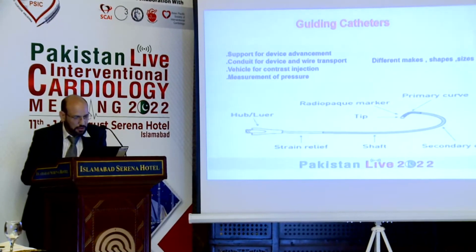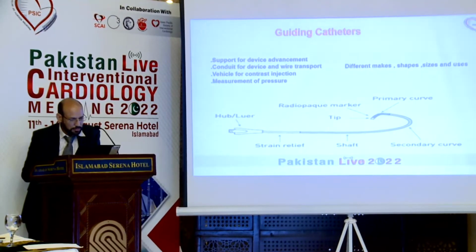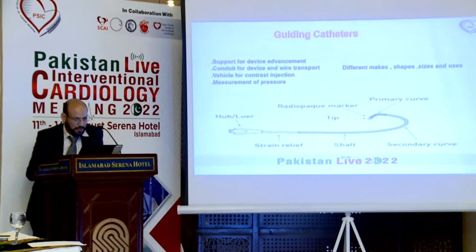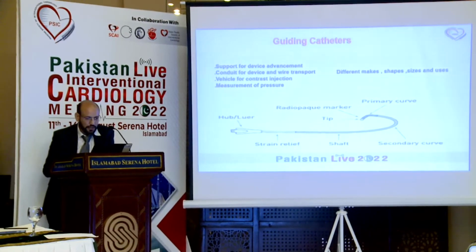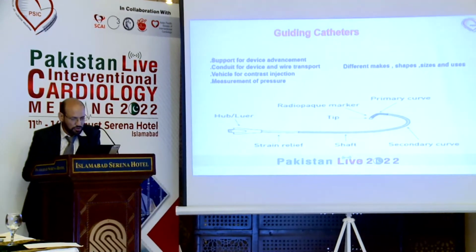You can see the parts of a guiding catheter. It has a luer hub and a strain relief part. This is the shaft, a secondary curve, a primary curve, a radiopaque marker, and a soft tip.